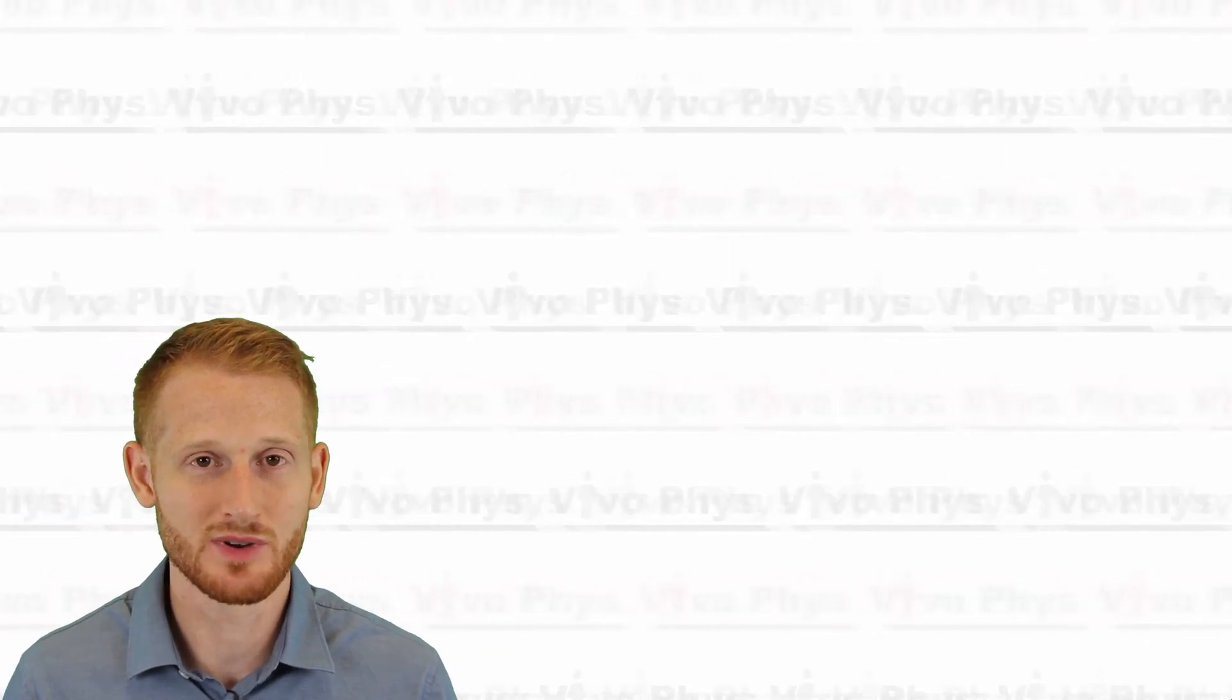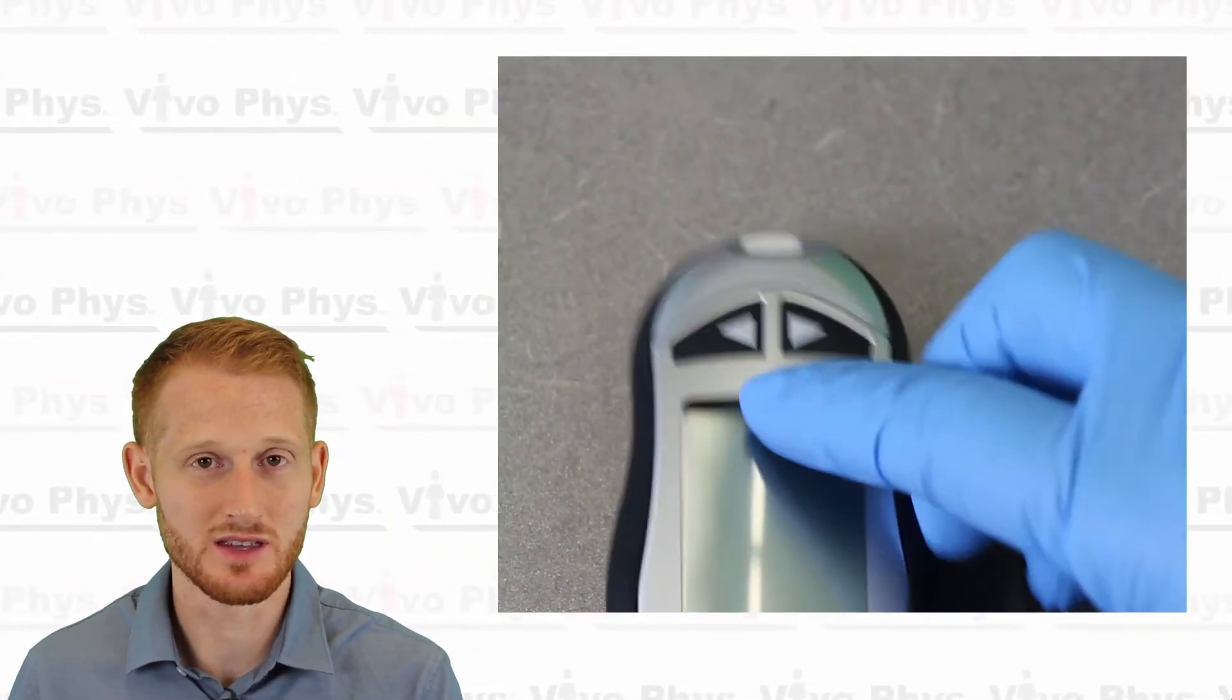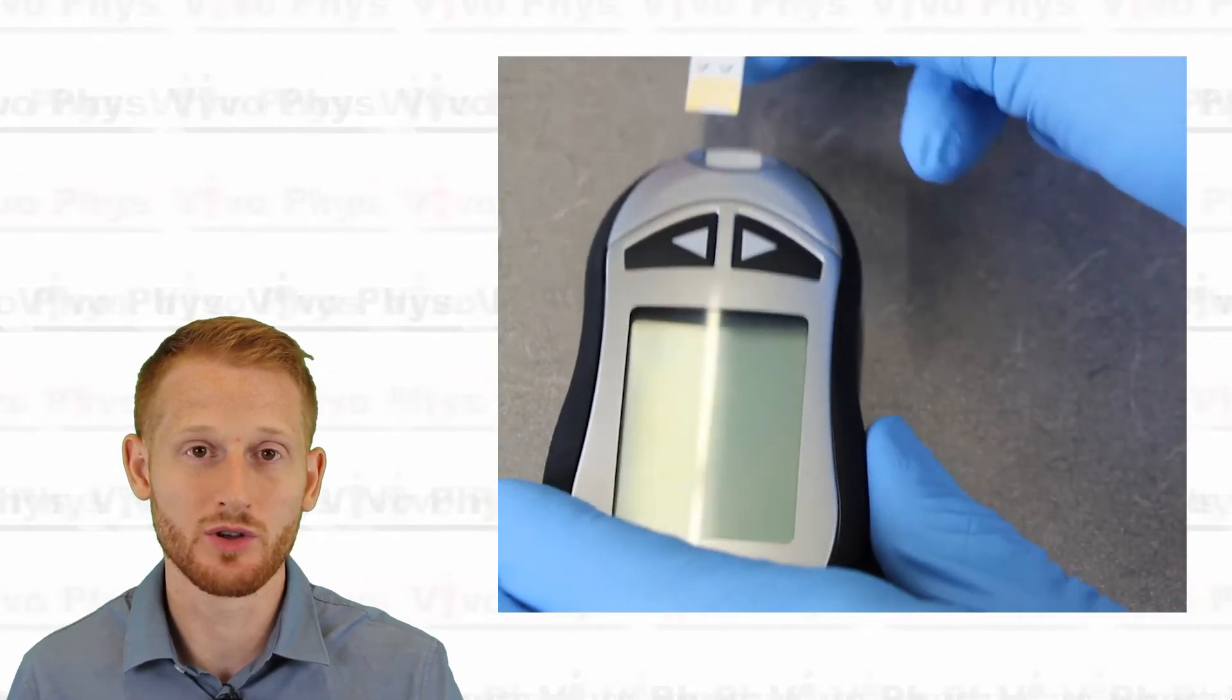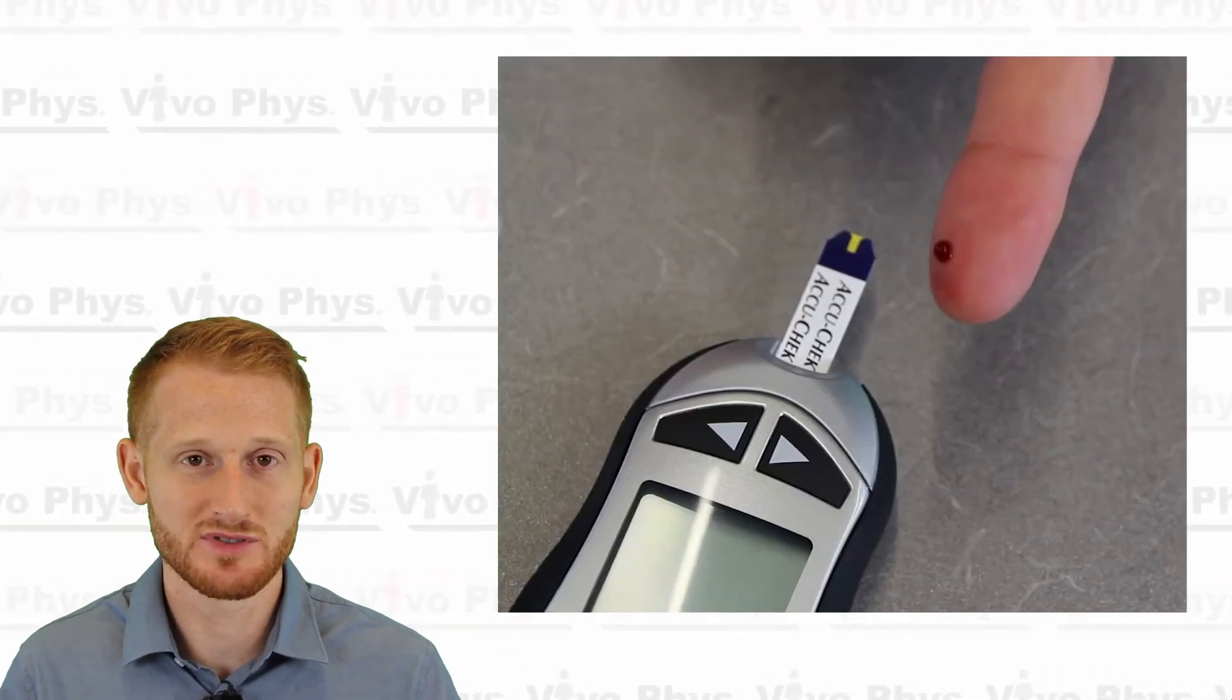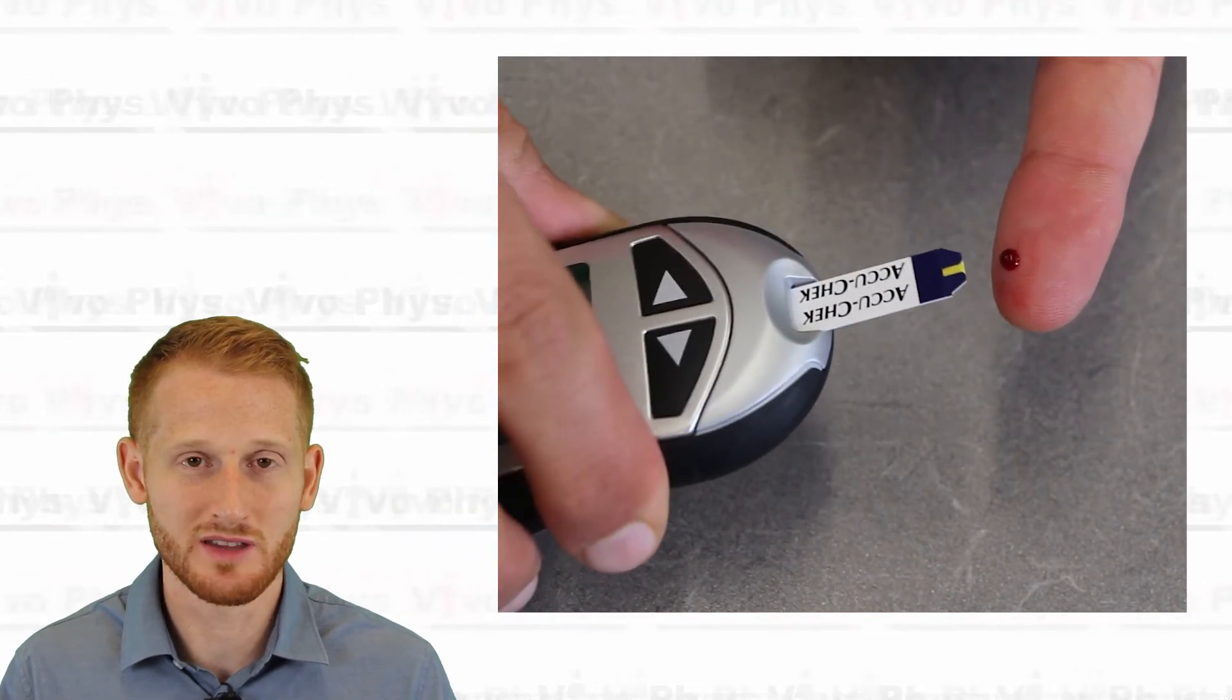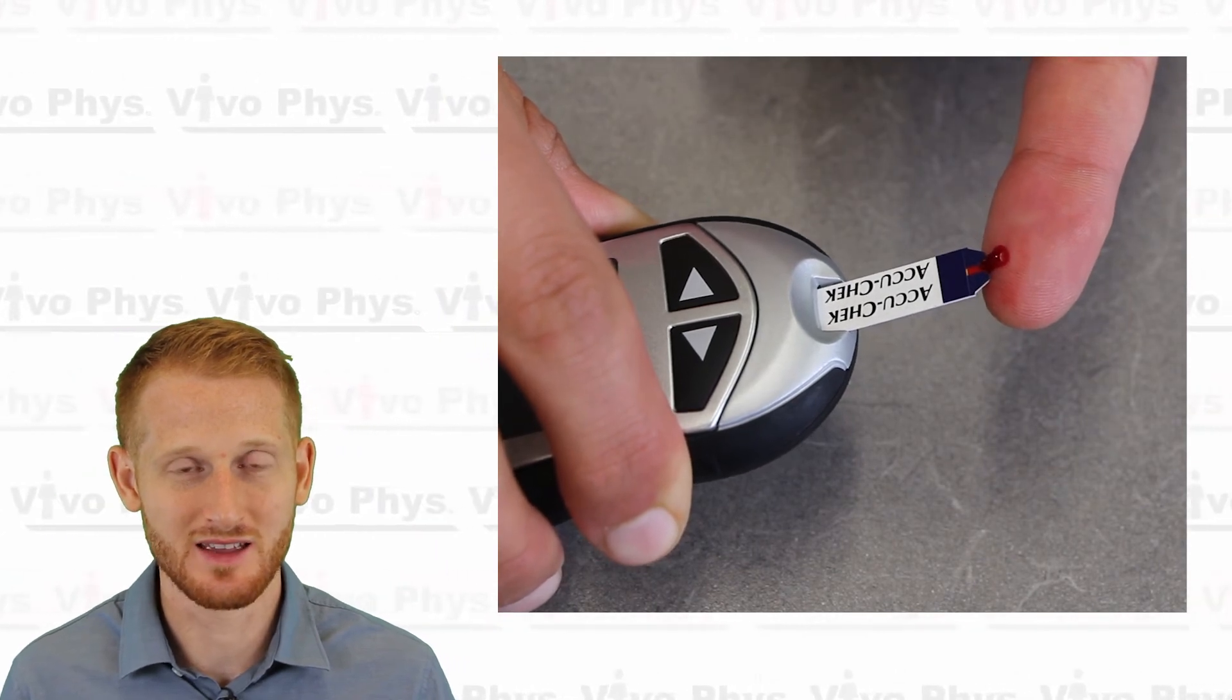So performing a blood glucose measurement is exactly the same as performing a blood lactate measurement. You're going to use a glucometer instead of a lactate meter, that's the only real difference. So you're going to take the glucometer and the glucose strip, and you're going to put the glucose strip into the glucometer, it'll activate the screen on the glucometer, and then you simply put the tip of the strip where the channel is against the edge of the bubble of blood that you create on the finger, and it's going to suck that blood into the strip just like it did with lactate.